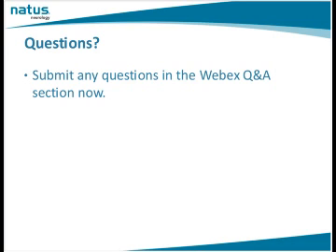That's an interesting question, and Diana, I'm not positive I completely understand the question. What I would suggest is that you save a picture at 50, and then save a picture at 40 or however distal you can get.